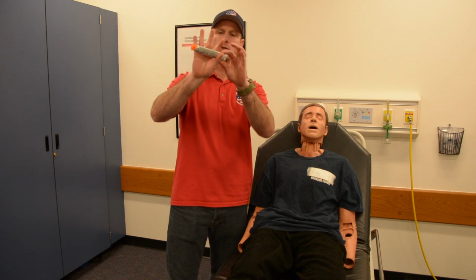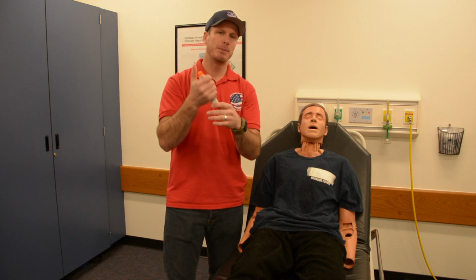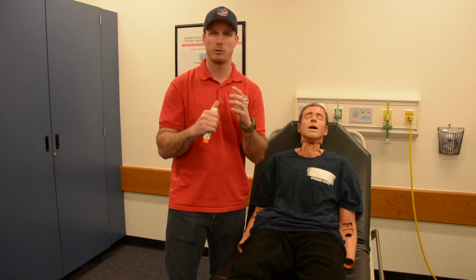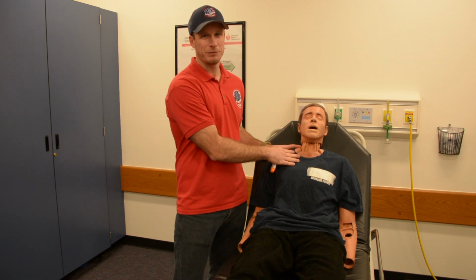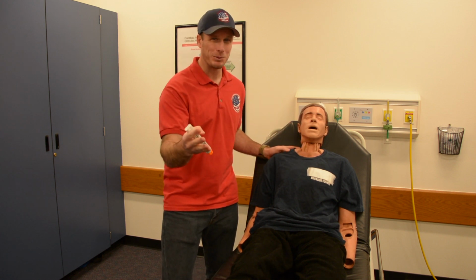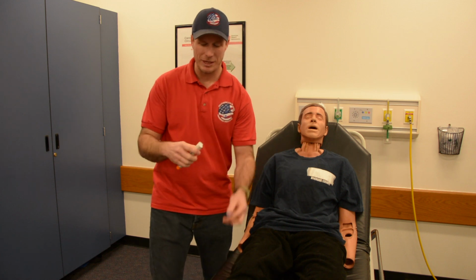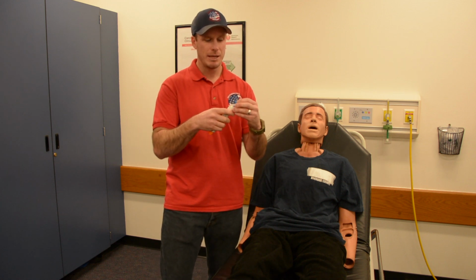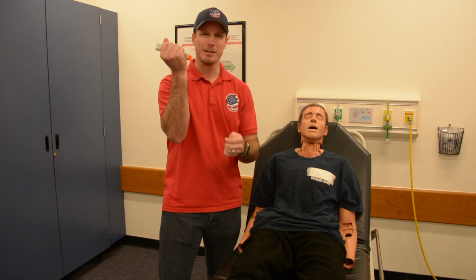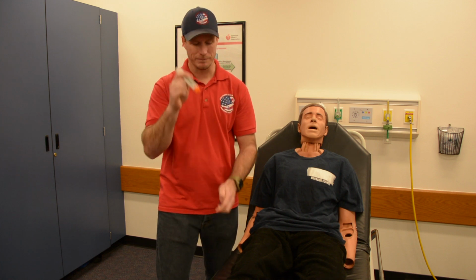When you grab your EpiPen, don't wrap your thumb around either side of it, because you might mistake what side the needle comes out of, in which case that needle will go through your thumb and your patient won't get any of their medication. This has happened, you guys. That's why we bring it up. So please, please, please don't wrap your finger around either side. Your safety cap will engage the needle, in which case, once that safety cap comes off, the needle typically comes out of the other end. If you're ever not sure, follow the directions on the EpiPen to make sure you don't mess it up.